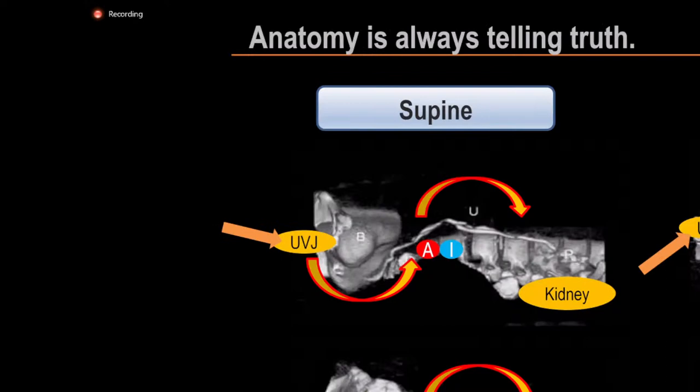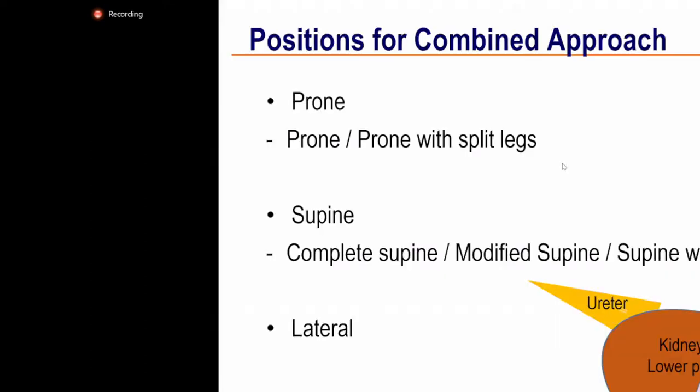When you consider the ureter course and easy application of RIRS, I absolutely prefer supine position to prone, because in supine position the direction to the ureter orifice, the ureterovesical junction, is quite straight. But the ureter goes upward to the common iliac vessels and downward from this point. But in prone position, the ureter goes quite straight compared to the supine position. The surgeons may feel difficulty approaching the ureterovesical junction at the initial period of surgery. So we have to think of multiple options for the patient's position, but okay, I'll move on to the next topic because of the time limitation.